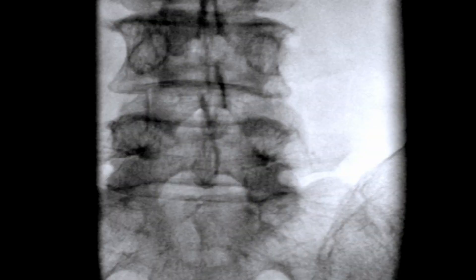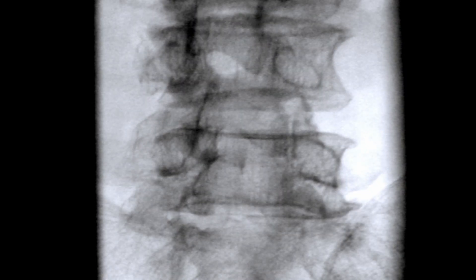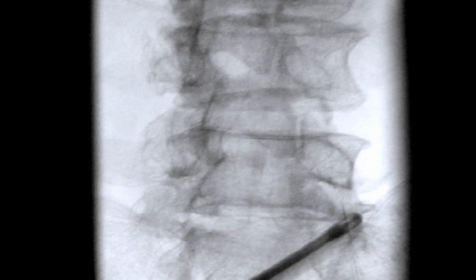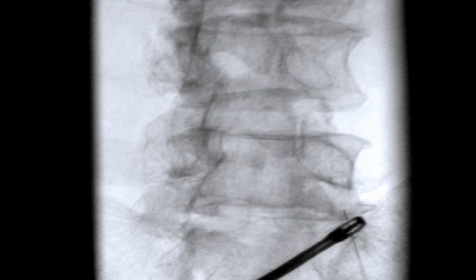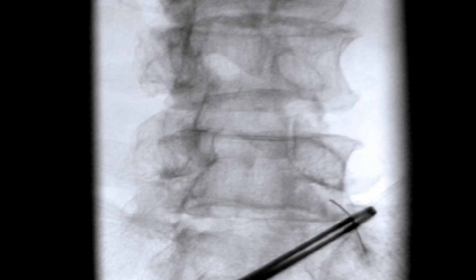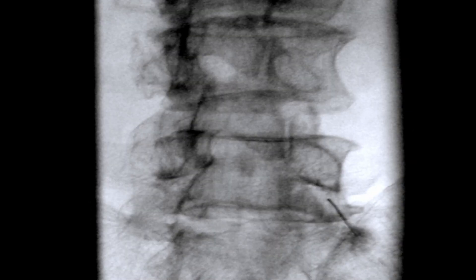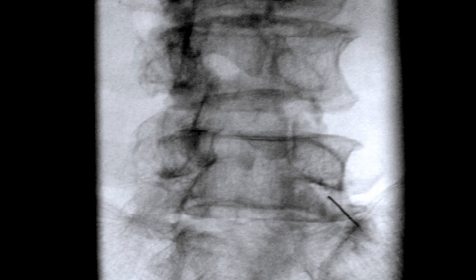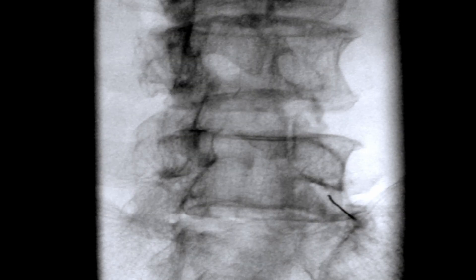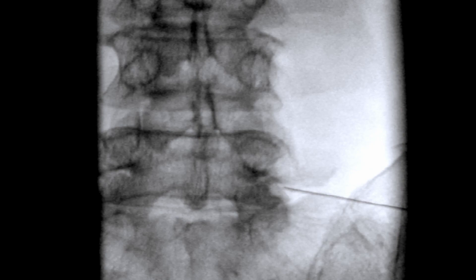In our upcoming cases, I'll illustrate how these adjusted, pragmatic approaches can effectively enhance contrast permeation. Subsequently, I'll present instances of suboptimal contrast distribution and introduce alternative strategies to redirect and achieve our primary injection target. In these complex situations, navigating the needle safely and avoiding injury to the nerve roots is vital. I always stress the significance of a procedure that neither causes additional pain nor worsens present symptoms, even though unexpected challenges might occasionally surface.